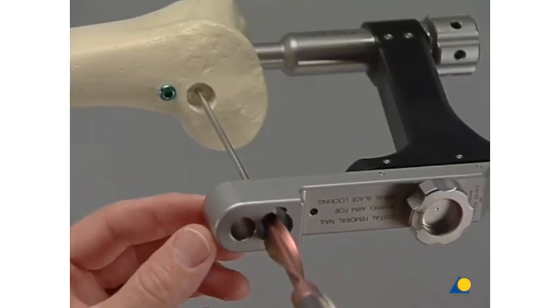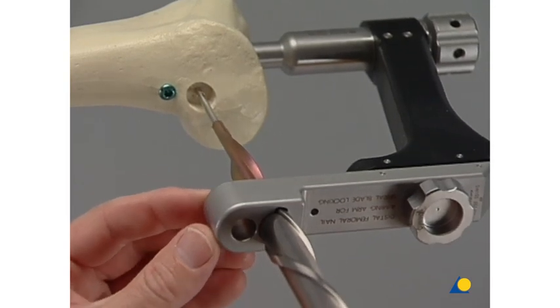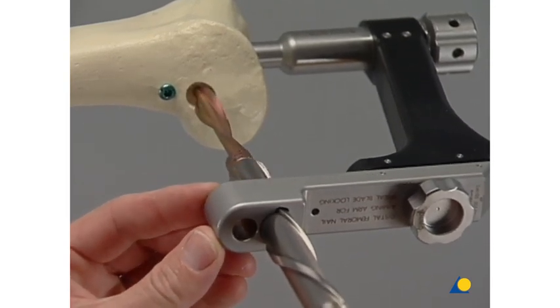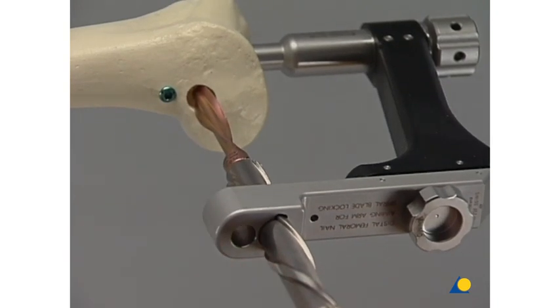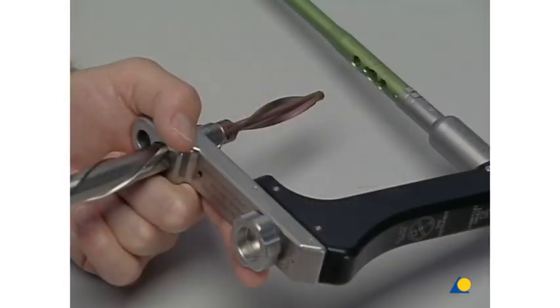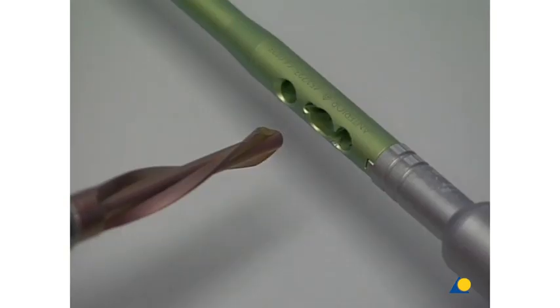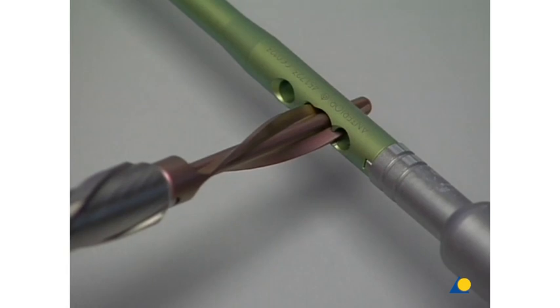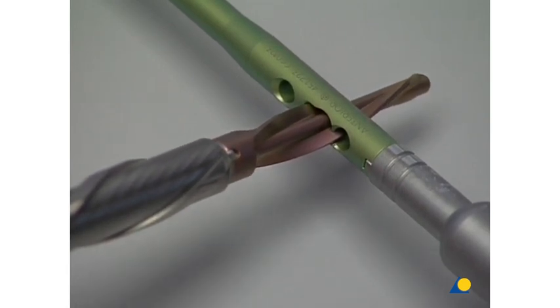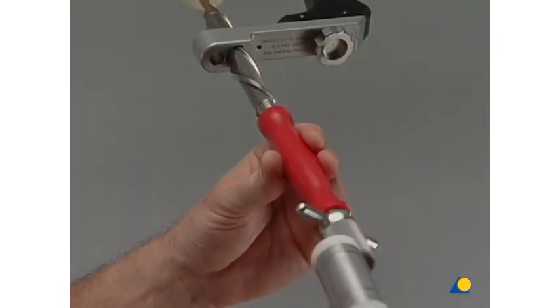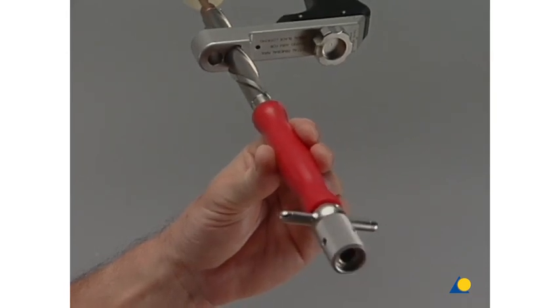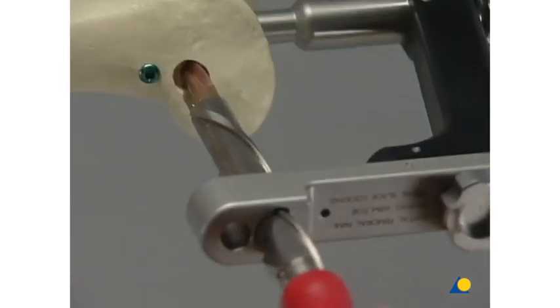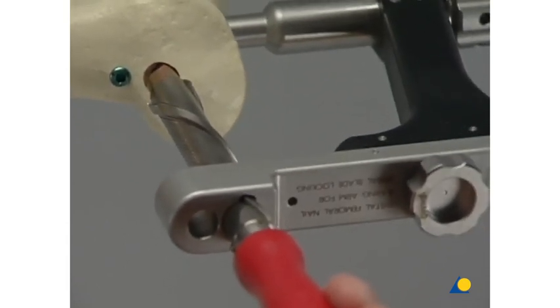The spiral blade is advanced over the guide wire onto the bone with the spiral on the spiral inserter placed in the notches of the aiming arm. The spiral inserter and the aiming arm are designed so that hammer blows to the inserter cause the blade to rotate, which allows it to turn through the slot in the nail. The blade is inserted with light hammer taps to the connecting screw. The correct insertion depth is reached when the head of the blade is flush with the lateral cortex.